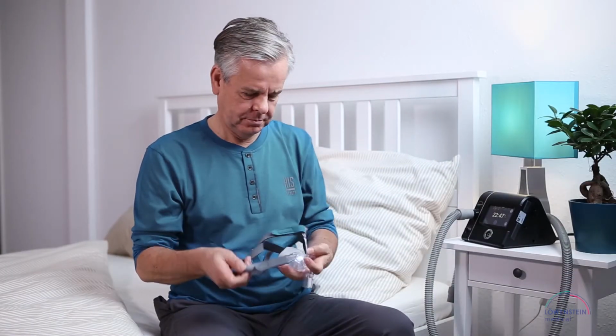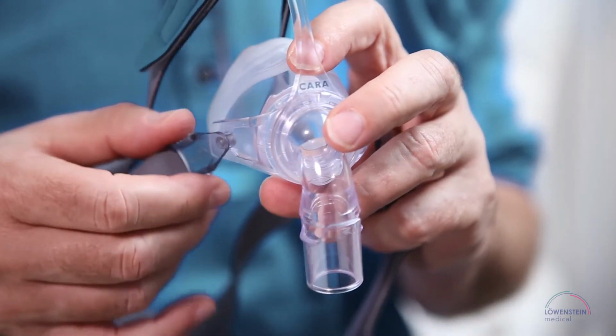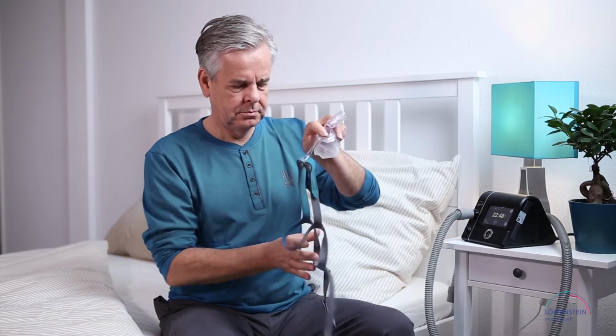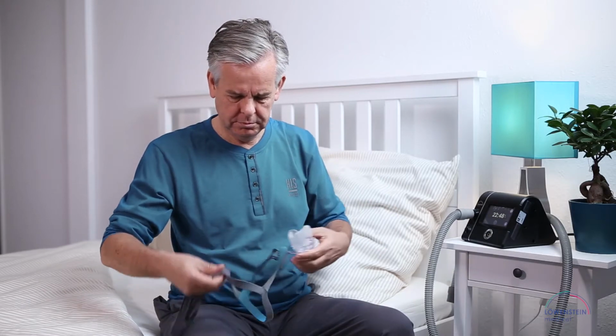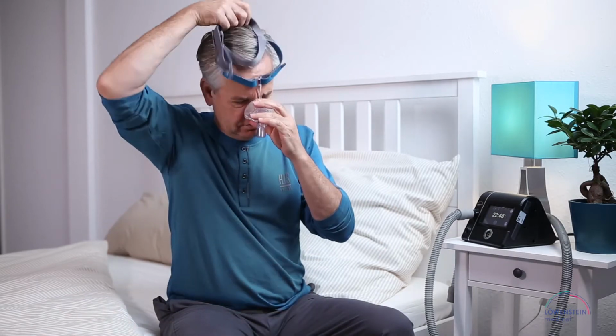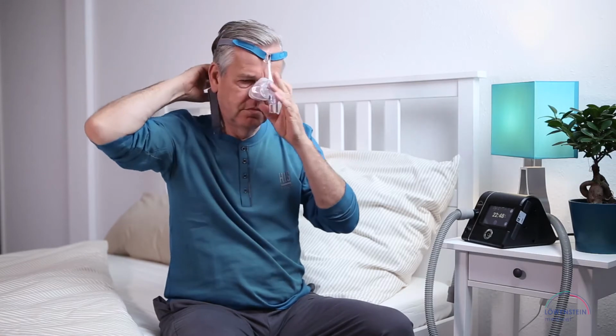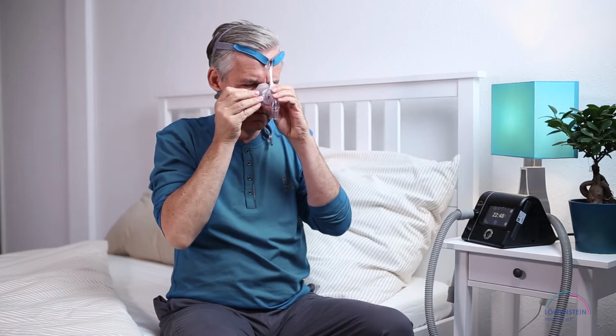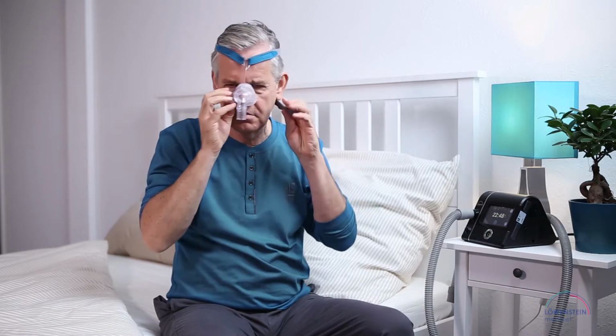Before you can put on the mask, you have to loosen both clips. Grasp the mask with one hand while the other holds the headgear on the back of your head. Pull the straps over your head and place the mask on your nose. Fasten the right clip and then the left.